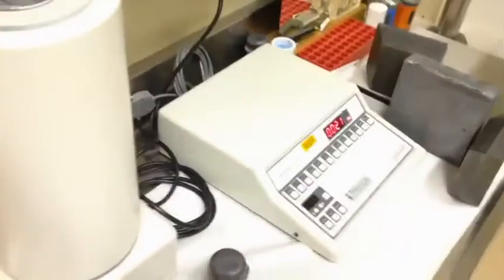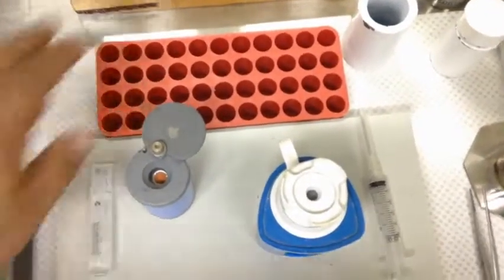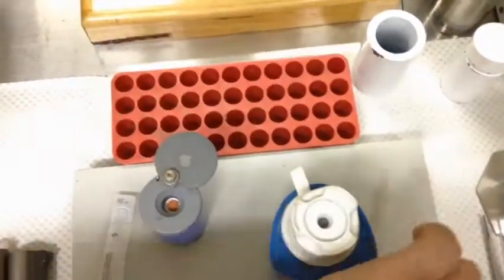The dose calibrator is to the side so we can quickly assay how much we draw up. And the little red pots at the back there are going to have my needle cap in them so I can recap without the risk of needle stick injury.